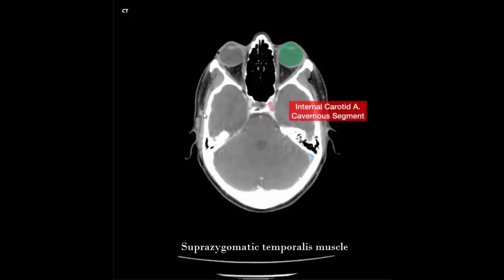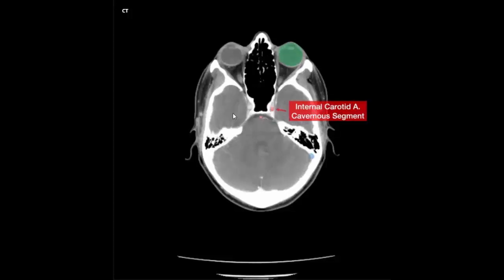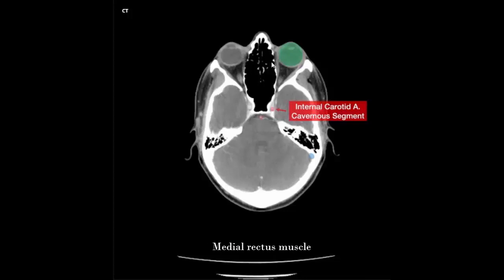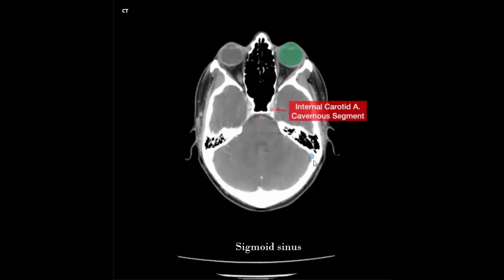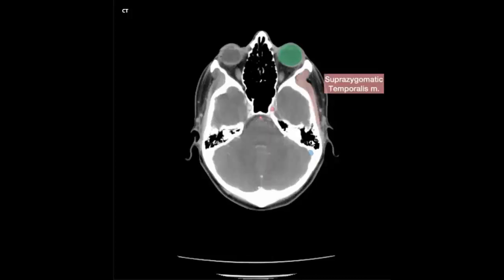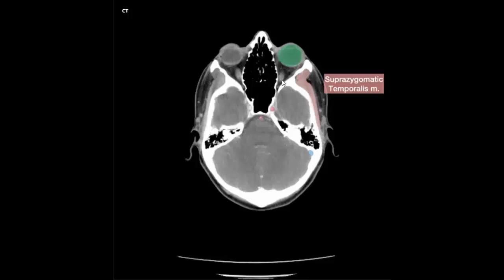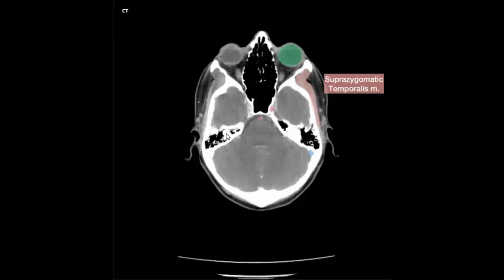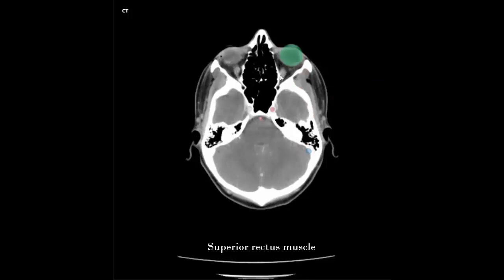Suprazygomatic temporalis muscle. Right and left globe, right and left superior rectus muscle, right and left medial rectus muscle, right and left lateral rectus muscle, right and left internal carotid artery, basilar artery, sigmoid sinus, right and left mastoid ear cell, right and left superior rectus muscle.